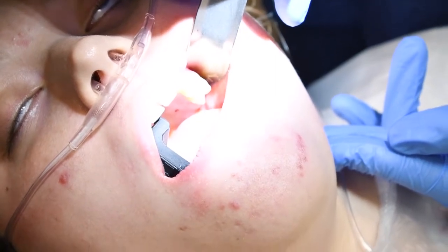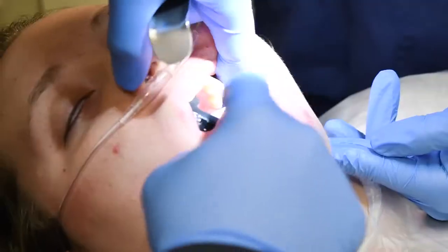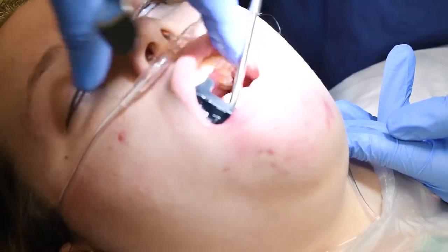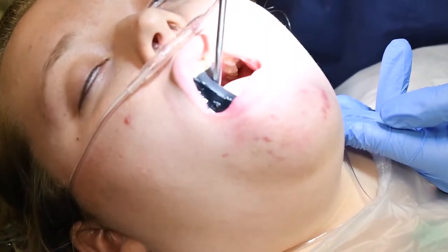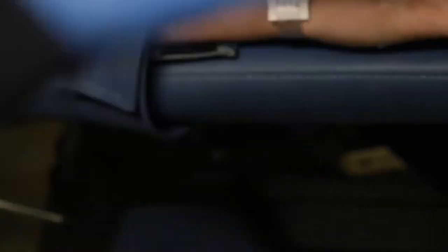All the local anesthetic is in for her. Now what we need to do is start taking out some teeth. I pull the bite block cord a little bit so I can get her lower jaw to swing off to the side — gives me a little better access. She's asking for a little more medicine, so she gets a little more of this, which I call 'milk of amnesia.'